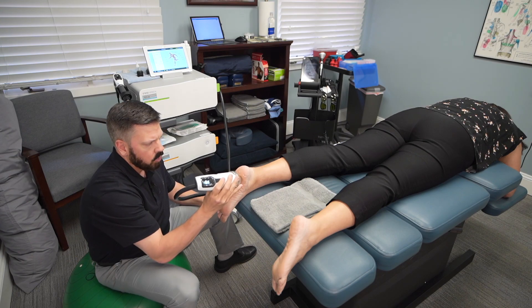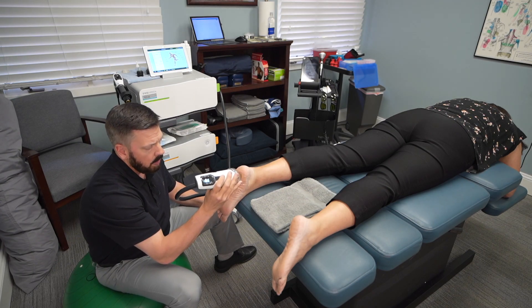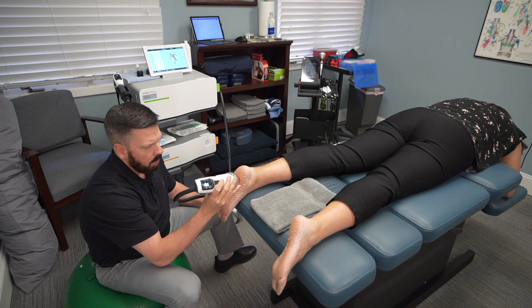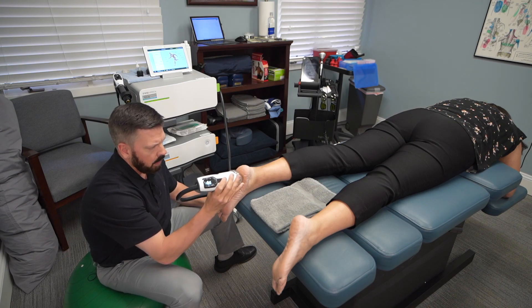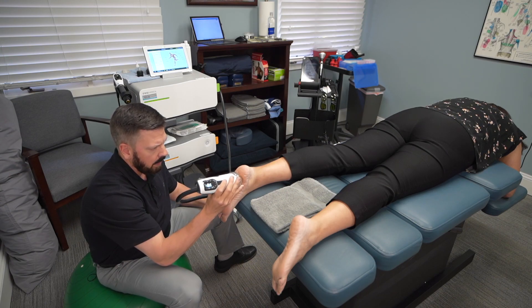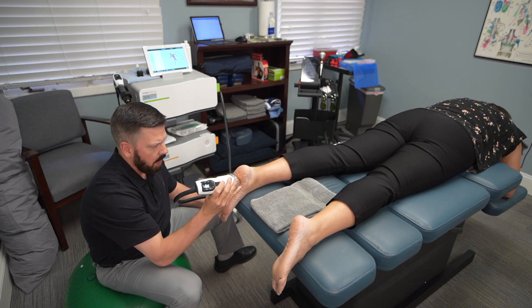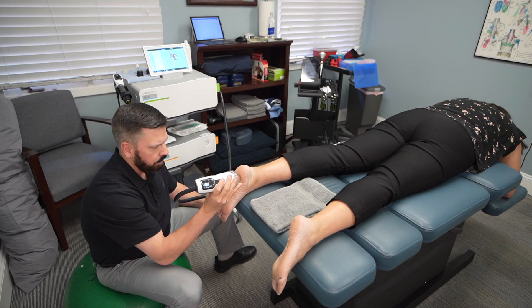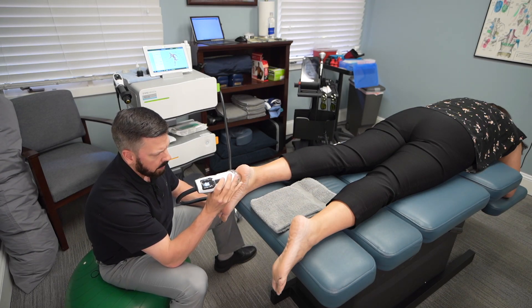What's great about this treatment is it gets very deep. Techniques like active release and Graston can get deep to a certain degree, but with the focus shockwave it gets even deeper. The problem spot is often really deep along where that plantar fascia attaches to the calcaneus, and when we get over that problem spot it'll feel like a deep dull ache — and once we hit that spot we know that's where to concentrate the treatment.